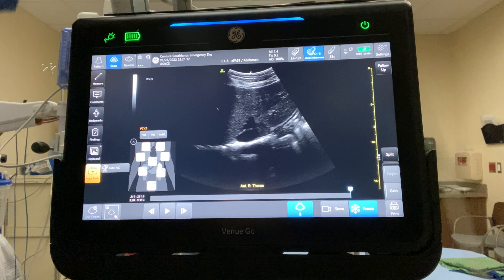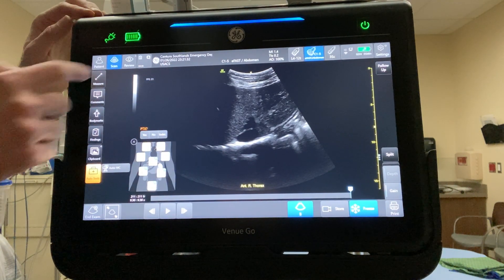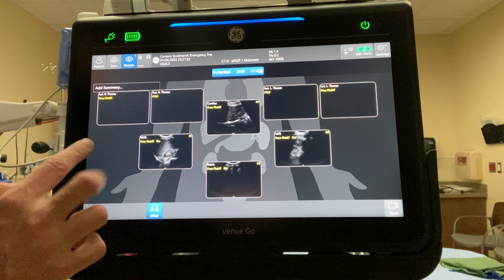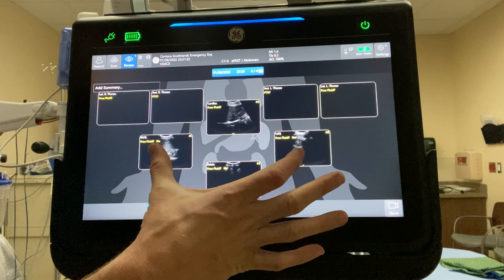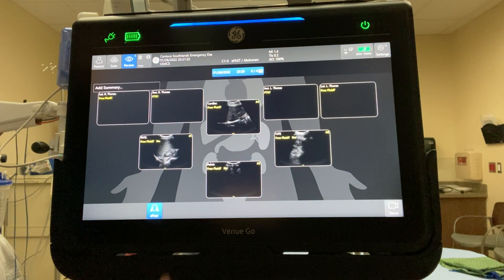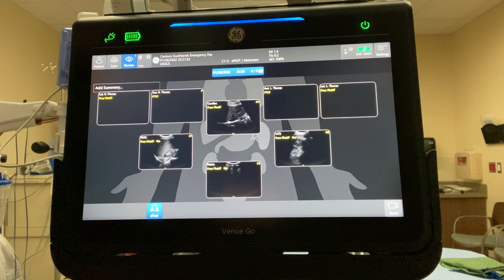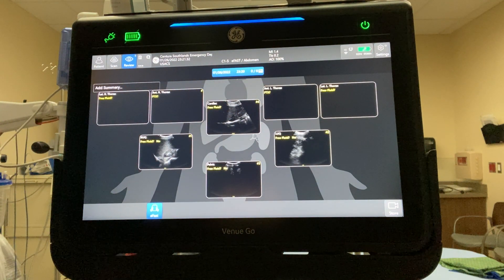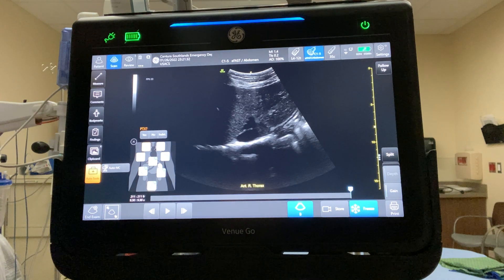At the end, once you've saved all your images, go to the review button in the top left corner. It gives you a screenshot of your entire FAST exam — lungs on both sides, cardiac window, two abdominal windows, and pelvic window all in one. You can save that composite picture as a store, so the whole image goes into the image archive, then click back to scan to continue.